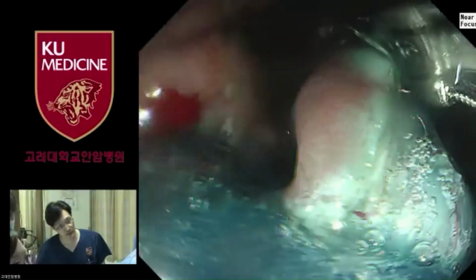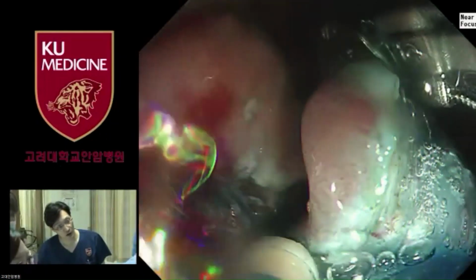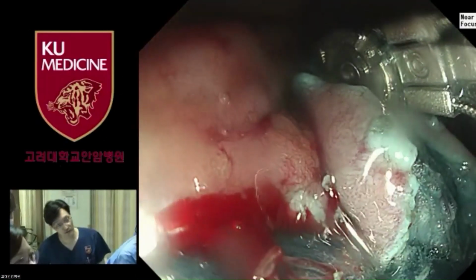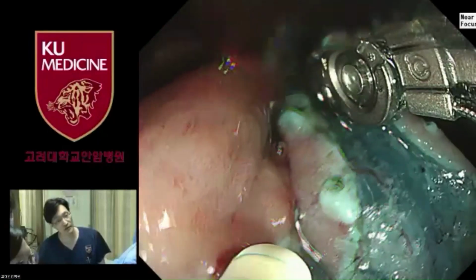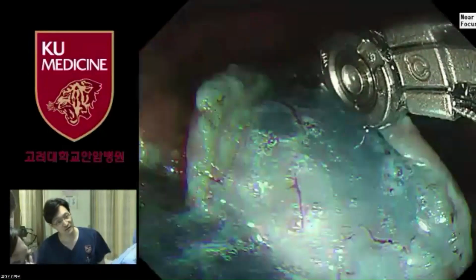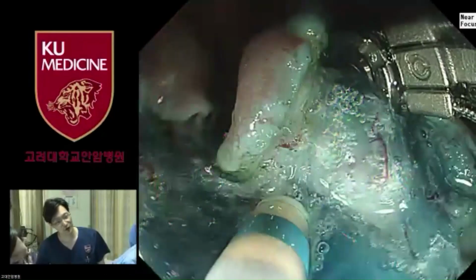We could use a more novel type of robot-assisted device maybe several months later. But anyway, this Alligator type already has approval, but commercially we still cannot buy this device in the market.